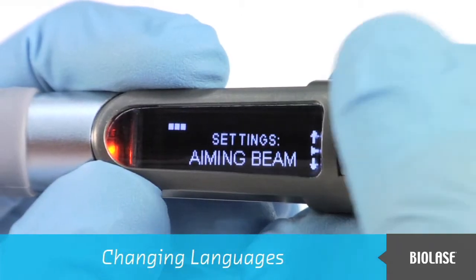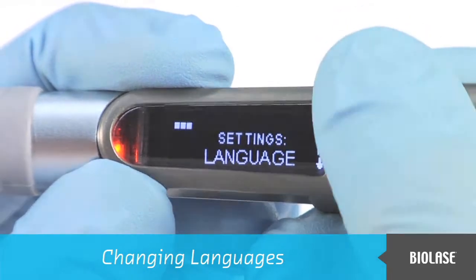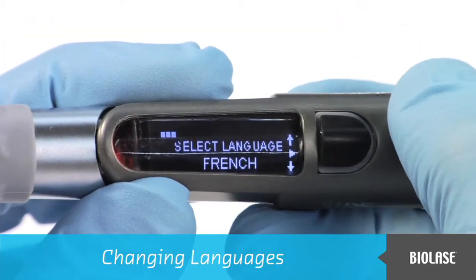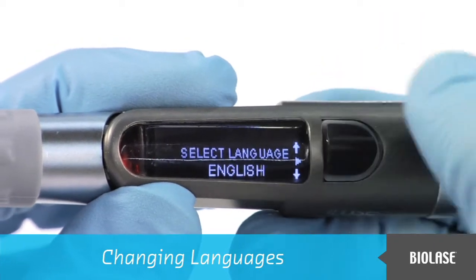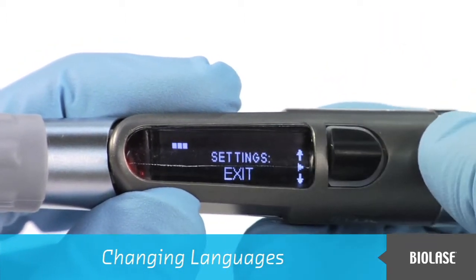To change languages, first enter the Settings menu. Scroll to the Language option and press in the navigation button. Then, scroll through the languages using the navigation button and then select your choice.